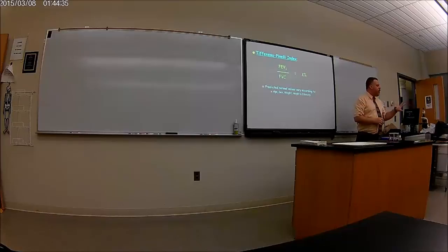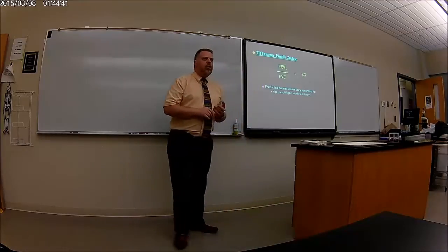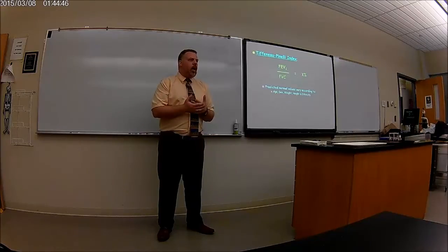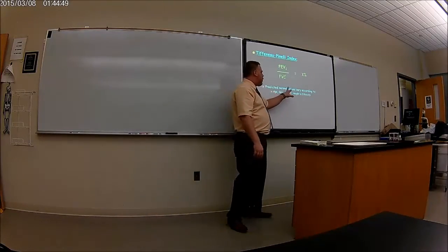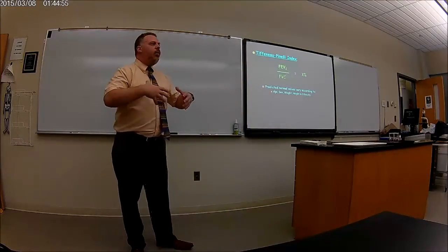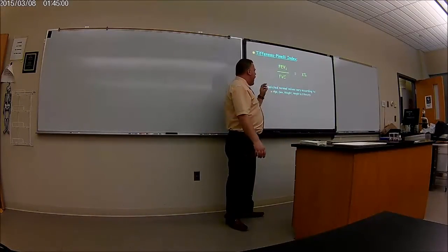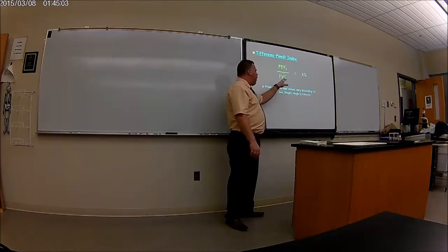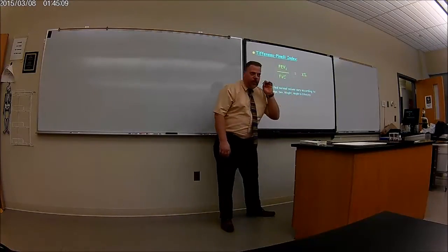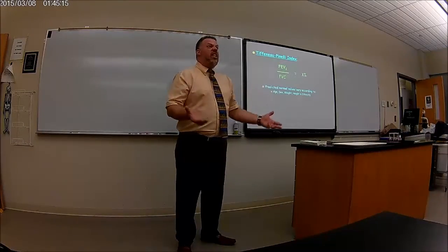Now, if we did the spirometry, you have to plug in all these numbers. It's different by the age, it's different by all these different factors. So before you do the spirometry, you got to put in your age, your sex, believe it or not, the weight, the height. Even if you're Indian, black, or white. Just to give you an idea, the average white male weighing 200 pounds at 5'9", at, let's say, 40 years old, the average should be, let's say, 6 liters.